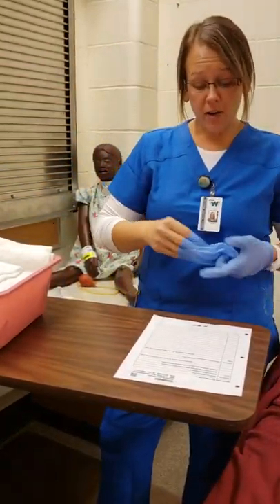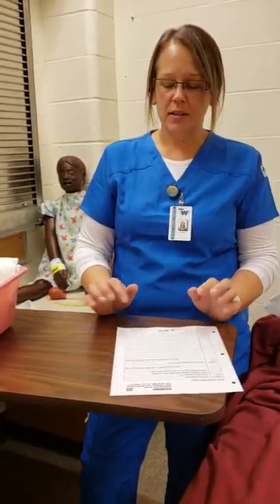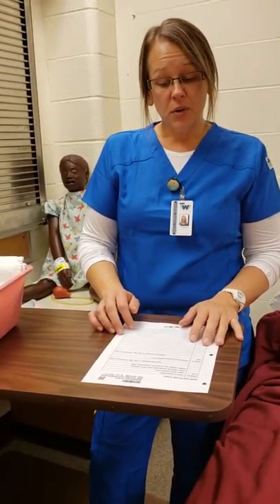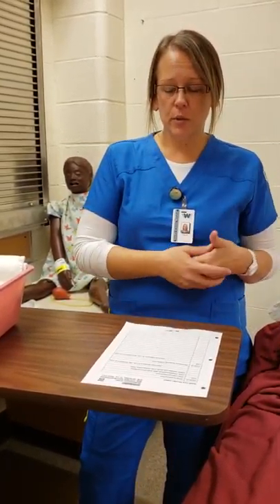I would take off my gloves, dispose of those in the trash, do my hand hygiene, and document exactly what just happened for the urinalysis. The next thing I'm going to do is insert an indwelling catheter, which follows the clean catch urinalysis we just completed.